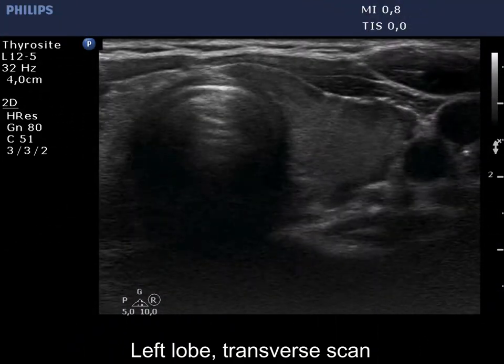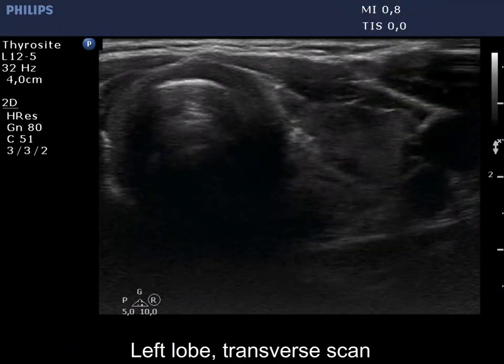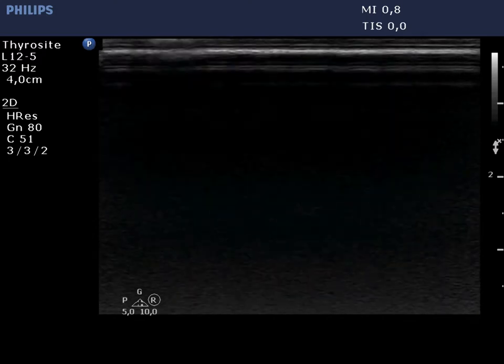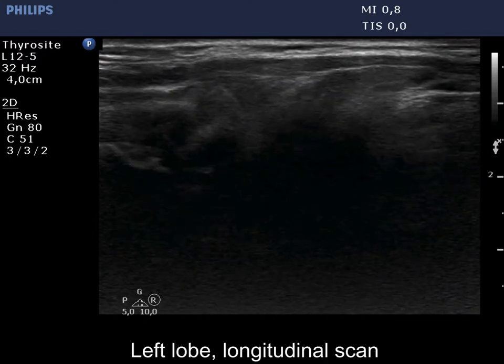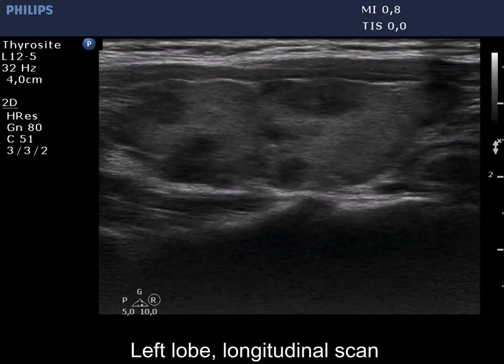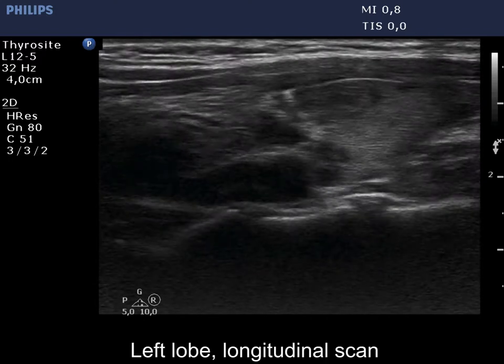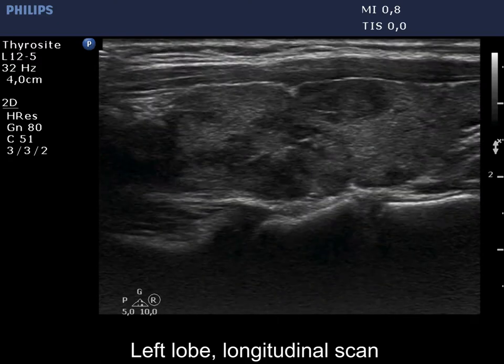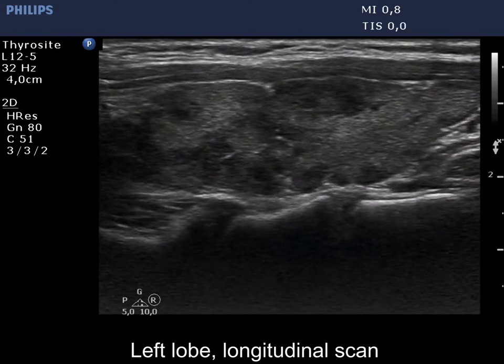The left lobe has a similar appearance. The discrete lesions are very likely not pathological nodules.